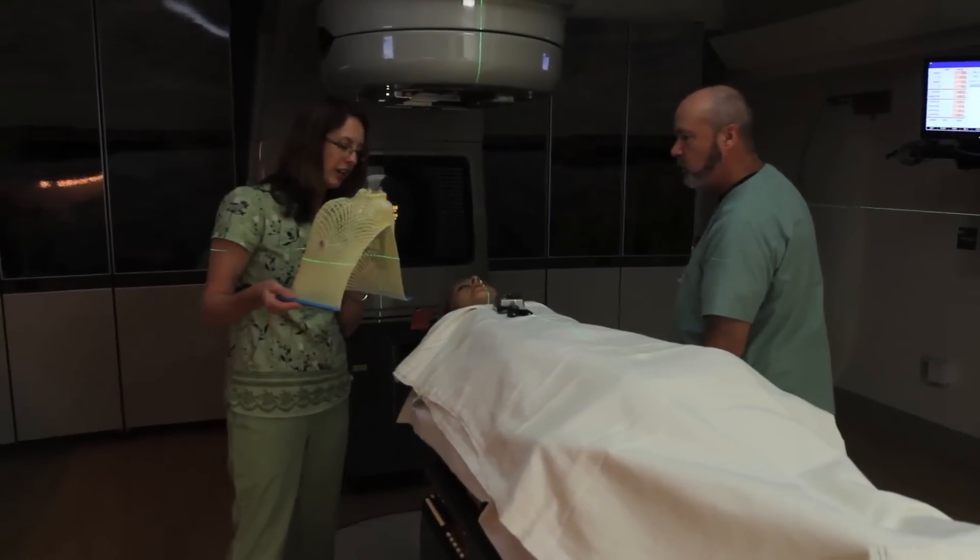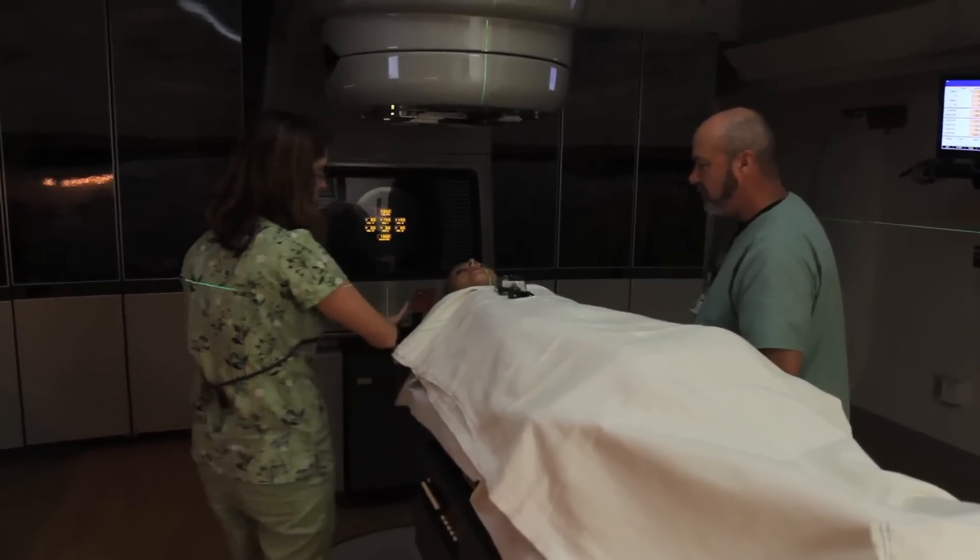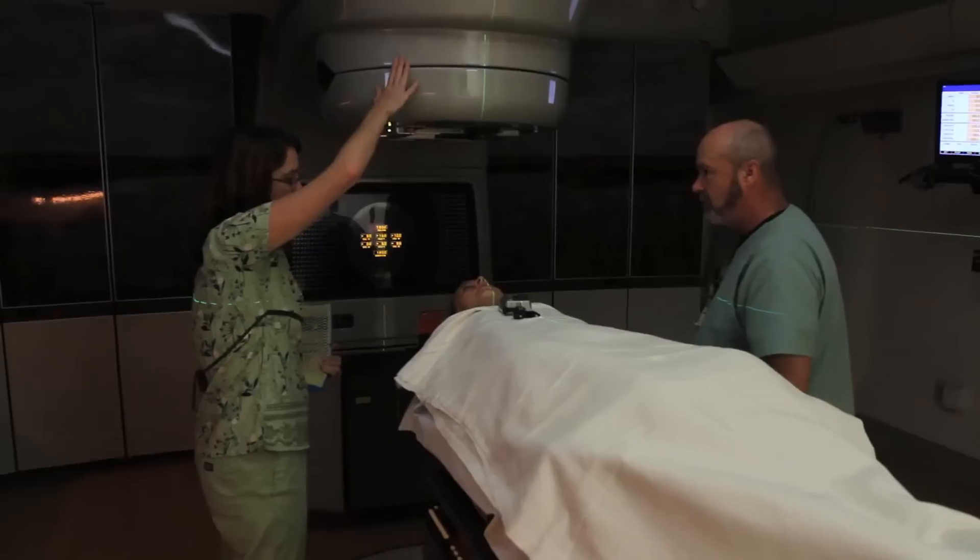So we're going to line up all these green lasers that you see on your marks on your mask. Nothing's gonna hurt. This thing just moves around and buzzes.